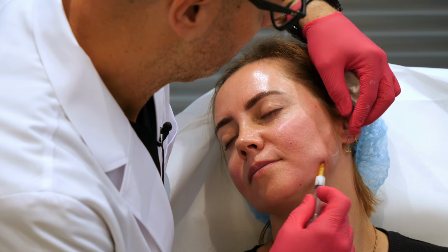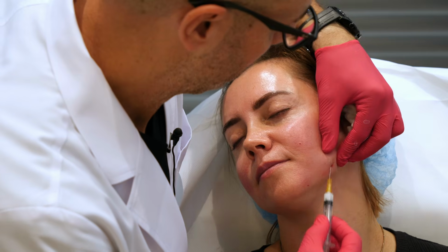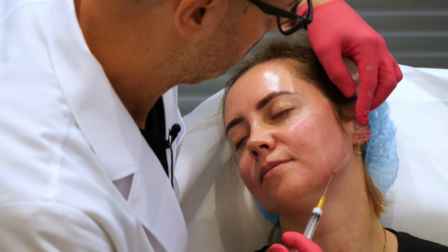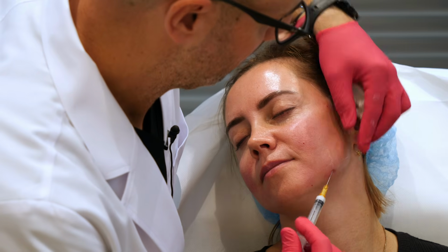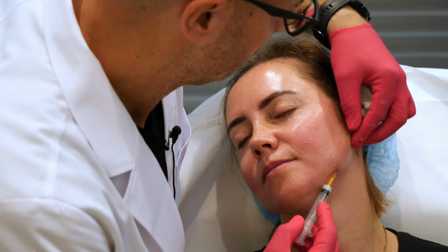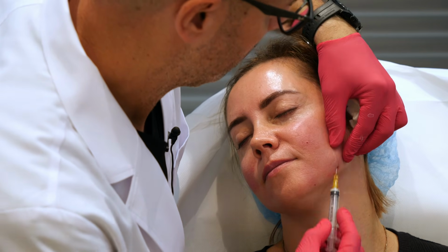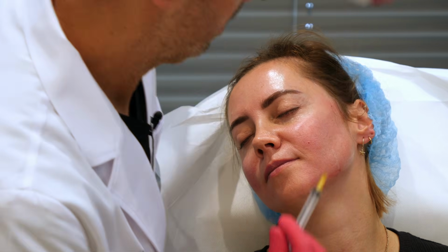Slowly, first deeper, deeper, and just now change to the superficial plane and put a little amount of product, and it's okay.